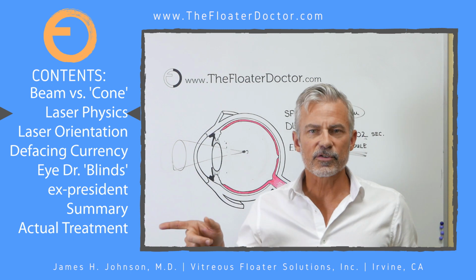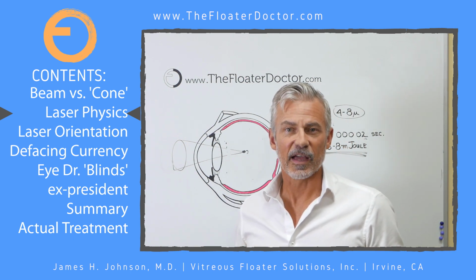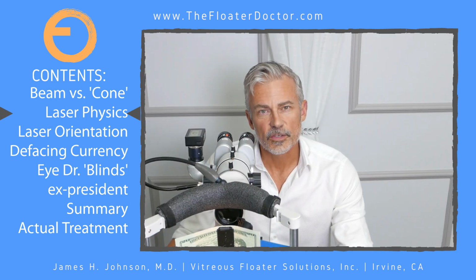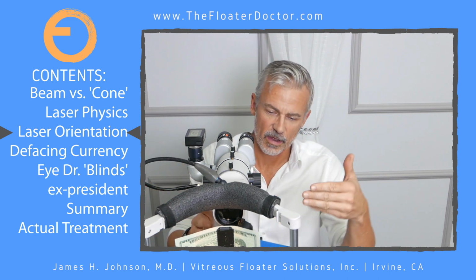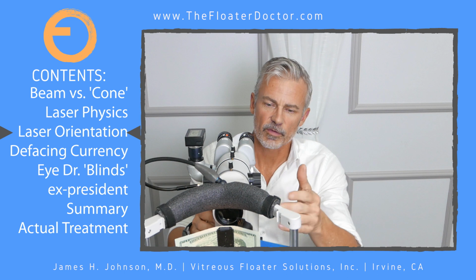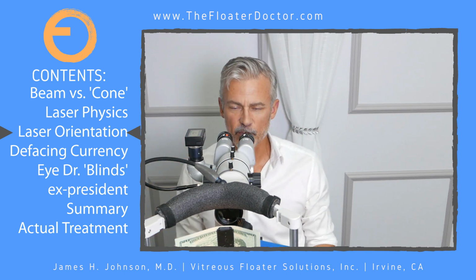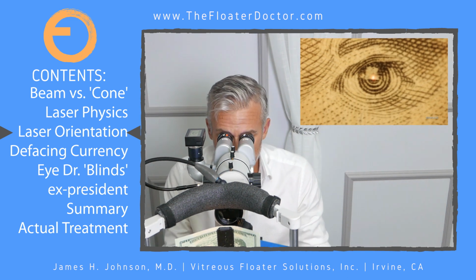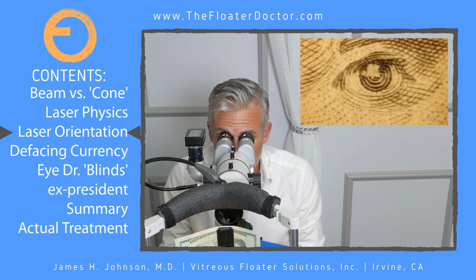So let's go back over to the laser and let's demonstrate this for you. And let's go ahead and commit that crime. Okay, so we're set up at the laser here. This is the YAG laser. What we got is our laser chamber down here. We've got our light source. We've got Andrew Jackson all in place. I've got my camera all set up. And as you can see in the inset, we have a quite magnified area of his right eye.